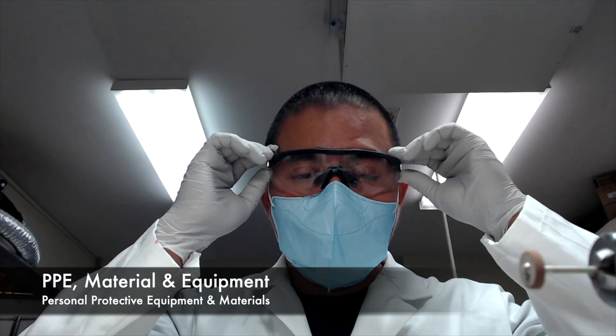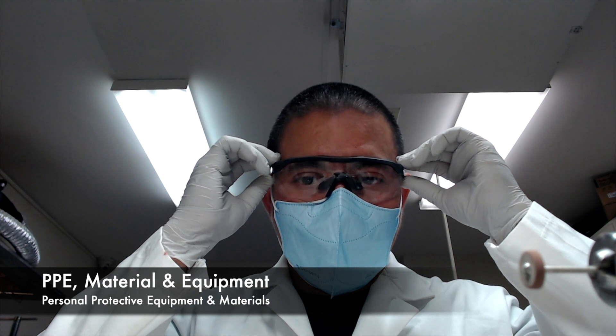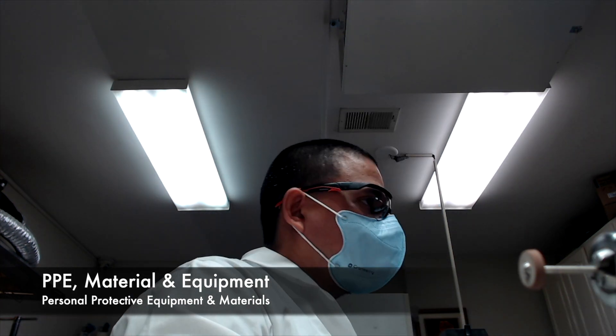To start, let's talk about wearing the proper personal protective equipment during this project. Whenever performing an acrylic repair on a complete denture, be sure to wear goggles, face mask, and gloves.